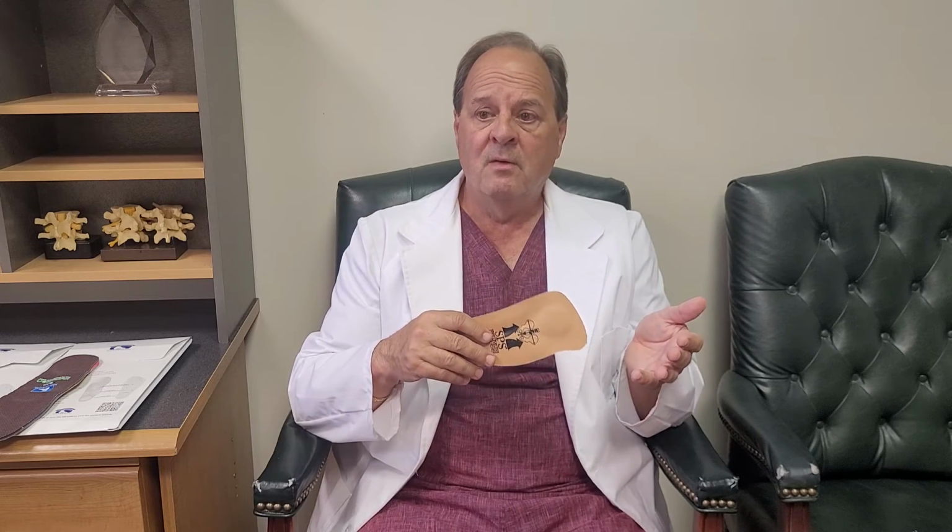In the beginning, my prescription is to wear the orthotic maybe 2 hours in the morning and 2 hours in the afternoon for 2 or 3 days. When you don't notice it anymore, or you barely notice the orthotic in your shoe, then you're good to go, and you should wear it anytime you have the shoes on.